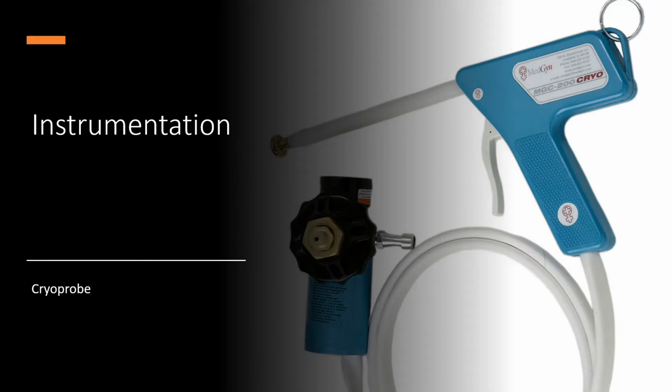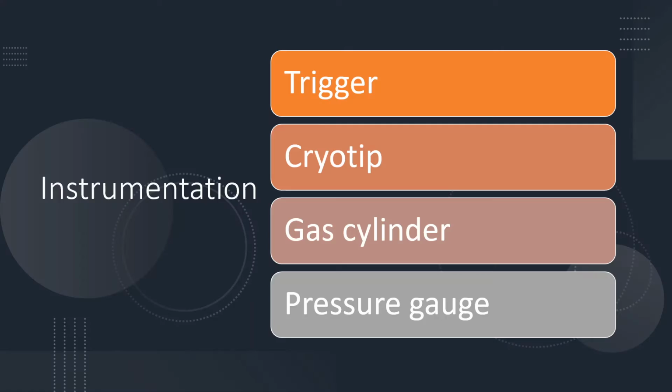So for the instrumentation of the cryosurgical unit, first we talk about the cryoprobe. The cryoprobe is a handheld device with a probe. It has a cryotip connected to the end if it is an indirect system, or a spray nozzle if it is a direct system. The cryoprobe is connected to the gas cylinder with a connecting hose, and the cryoprobe has a trigger, a pressure gauge, and a cryotip, which we will discuss in the next slide.